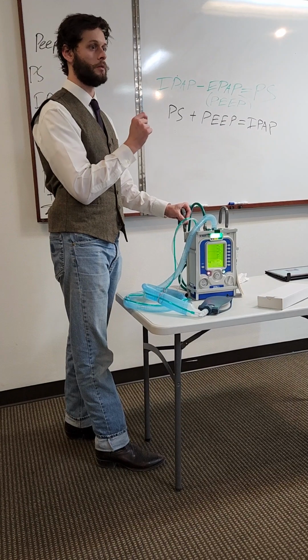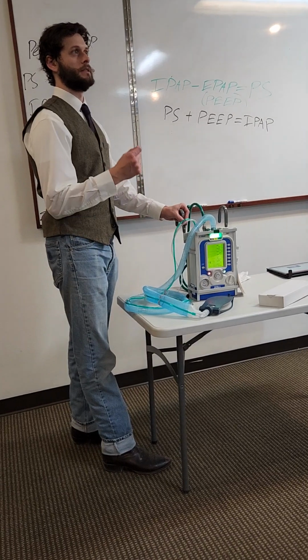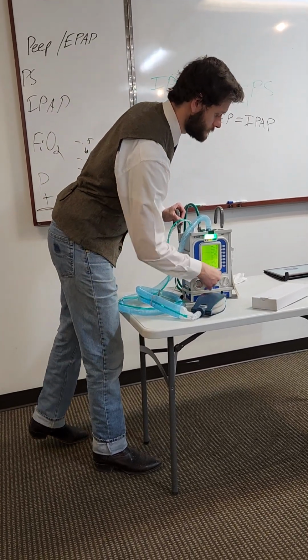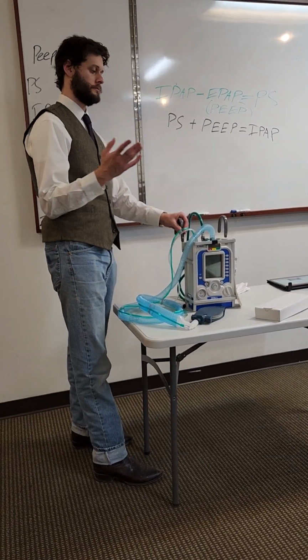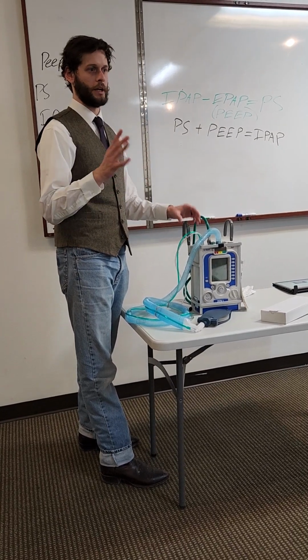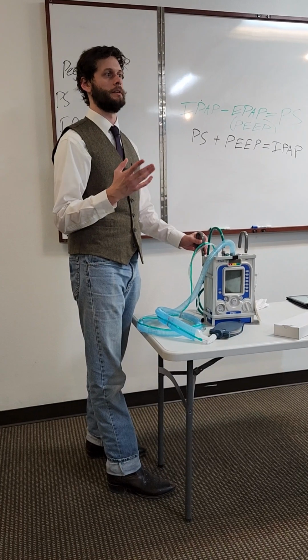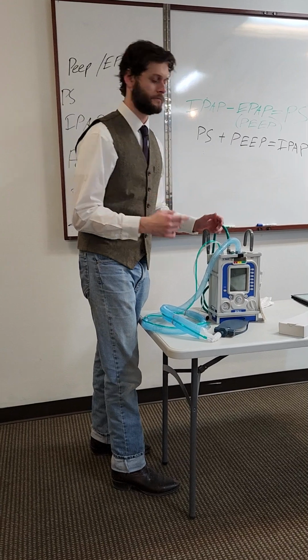Is that one part is just, I'd say it's unfortunate that they put it where they did. If they had found a better spot for it, I think that it would have worked out better. And that is, I guess, the totality of just the CPAP bi-level mode, whichever you want to call it by. It's not a very complex setting. It's mostly regulated by the patient, but getting to that pressure trigger is weird. It's not a good spot.